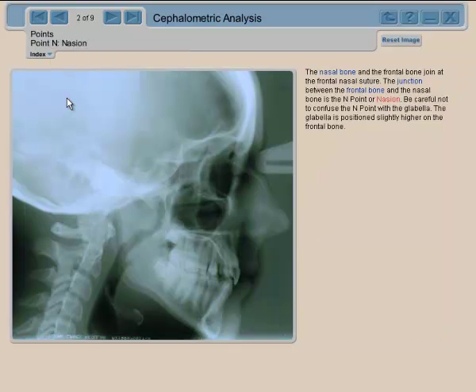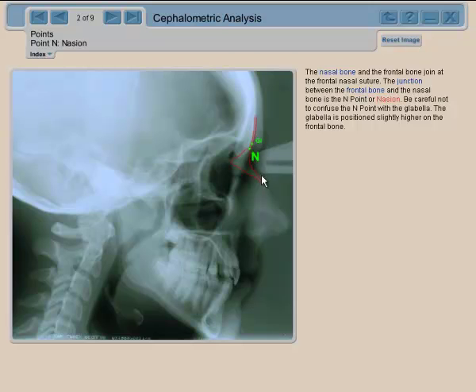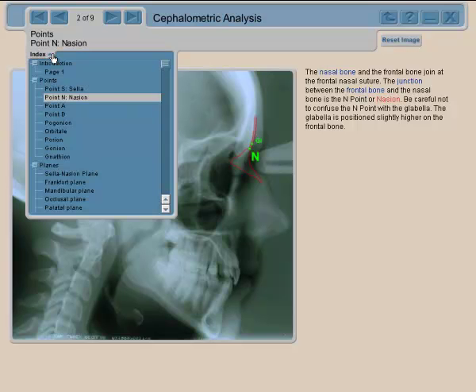As an example, point Nasion is located right here. It's the point that marks the junction between the frontal bone and the nasal bone. Once you determine some points, then what you want to do is get some planes.